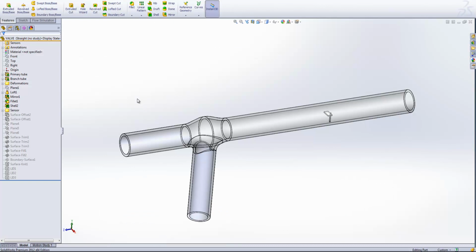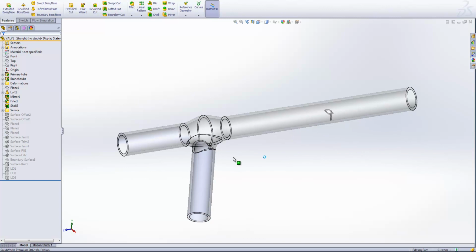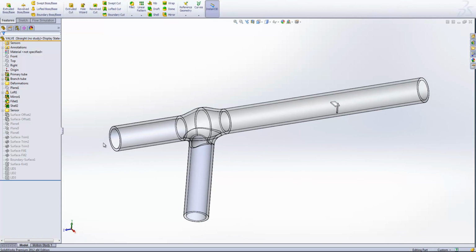So what we've got here is a very simple system. I've got two tubes which are serving as inlets here, and I've got one single outlet. So ideally what we're looking at here is mixing two different fluids. So we've got a water inlet here and an ethanol inlet here. And we want those two fluids to mix well, so that when they reach this body here that I've stuck in, which is going to represent our sensor. So perhaps we're designing the entire system, perhaps we're just designing the sensor, who knows.